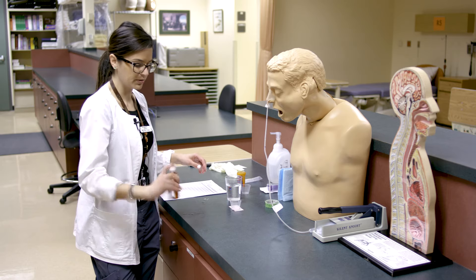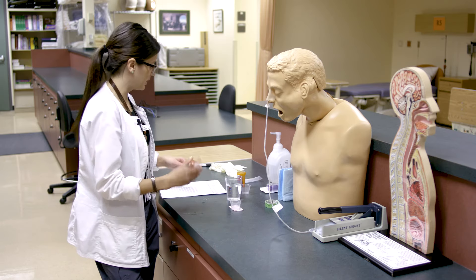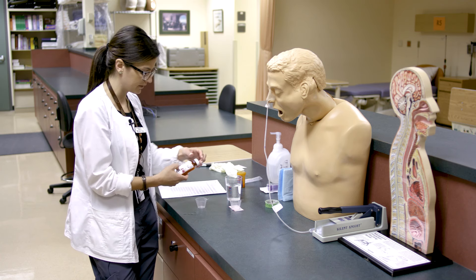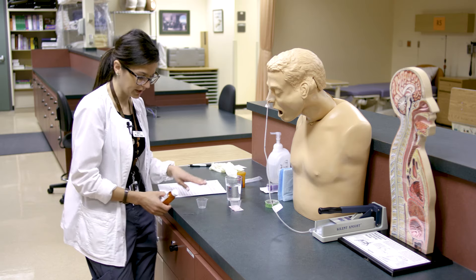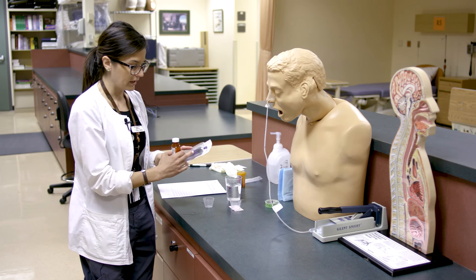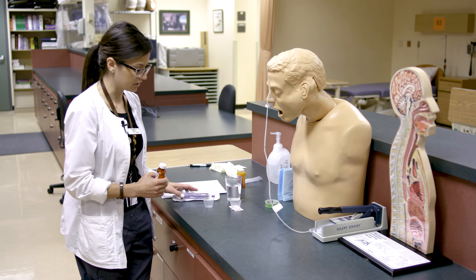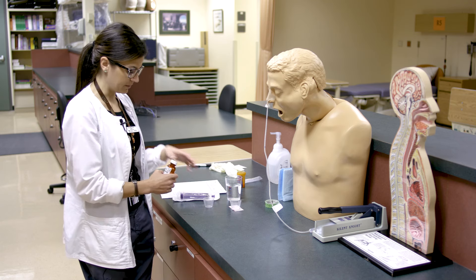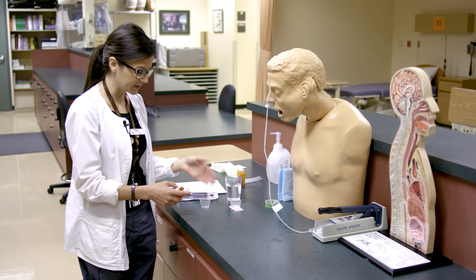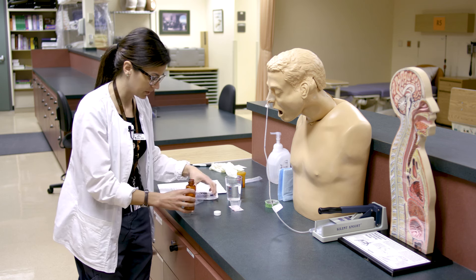Now we'll move on to the Dilantin. Since it's a suspension, shake it really well to disperse the medication — sometimes you can see it collect at the bottom. For the 10 mLs needed to get 250 milligrams, you could pour it into a med cup and get to eye level, but for less than 10 mLs you'd want to use an oral syringe to measure. For 10 mLs you could reasonably pour it, but a syringe is a little more accurate.